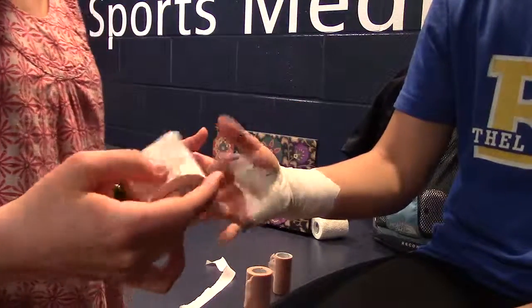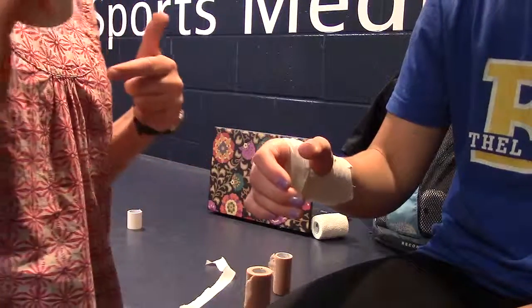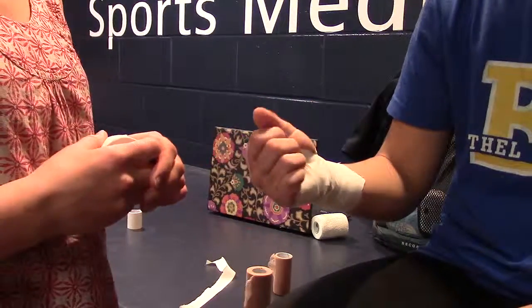They're done, and we just make sure she has good circulation in her fingers. I forgot to say at the beginning — make sure you ask if they want spray in here, and just make sure it holds nice and tight, not too tight, not too loose. And there you have it.